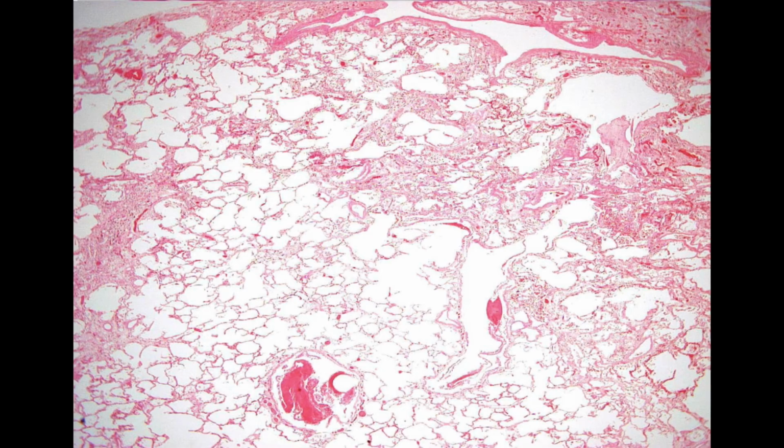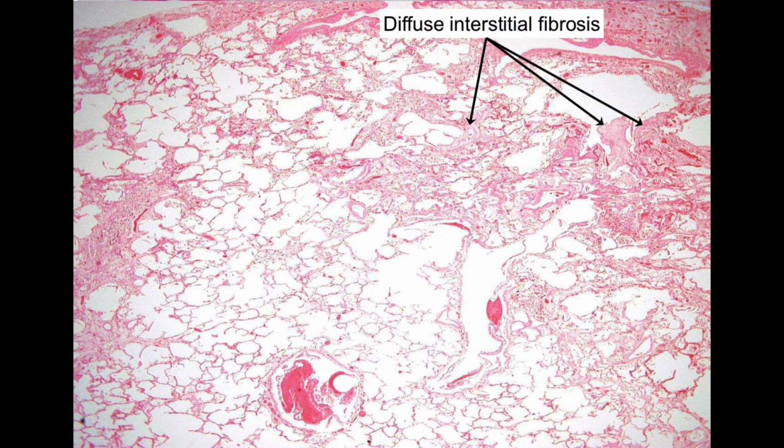We will now discuss the microscopic appearance of asbestosis. The slide we see here was prepared by staining a biopsy of the lung tissue with hematoxylin and eosin. At low microscopic magnification, you will be able to see large areas of interstitial fibrosis, which ablate the alveoli or degrade their air exchange function.